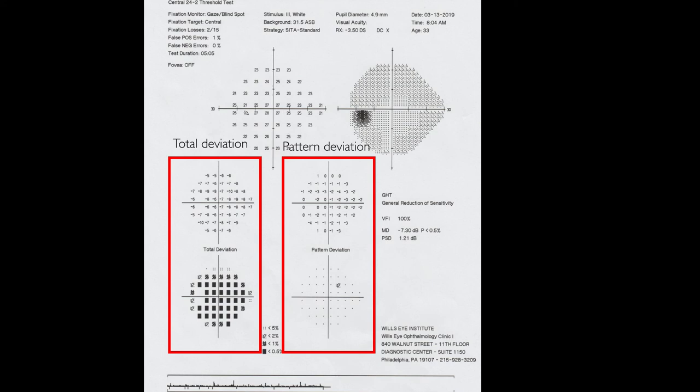Total deviation and pattern deviation are displayed in numeric value and in plots. To interpret the plot, we need to look at the scale that is located between two red boxes.